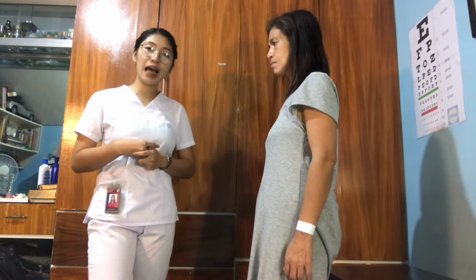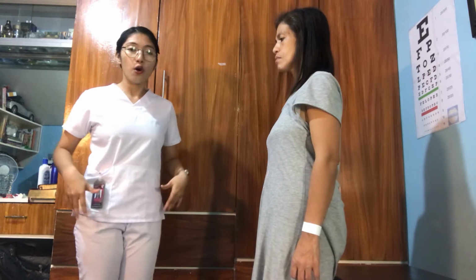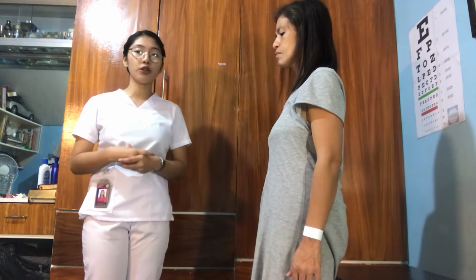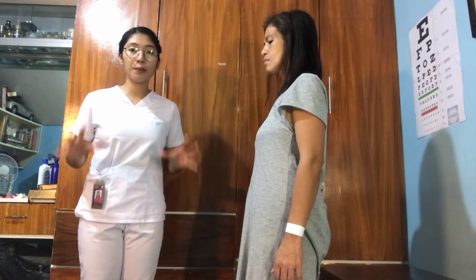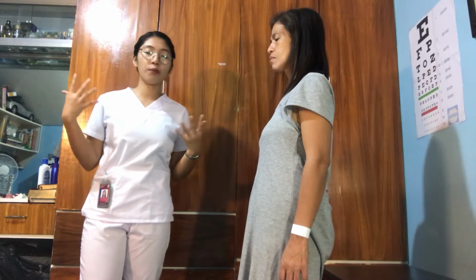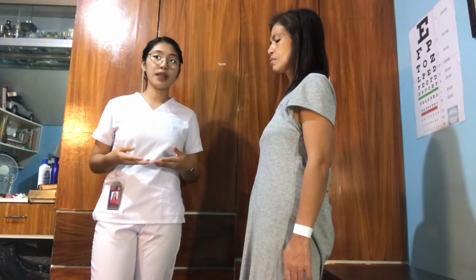And then after that, we need to also make sure that once the patient stands on the weighing scale, the weight of the patient would be on both feet, and there is no bending or leaning sideways, so that the weight of the patient would not be altered.